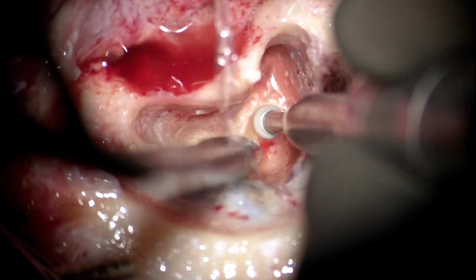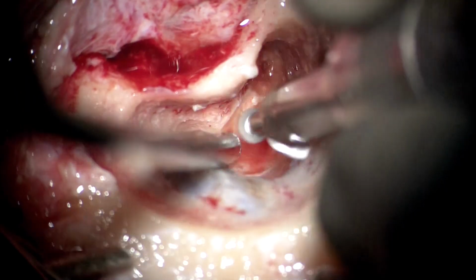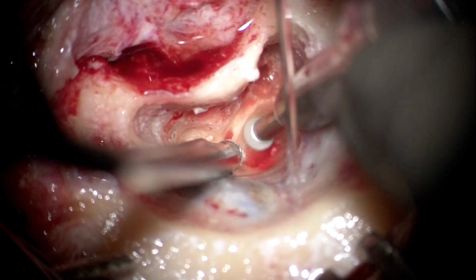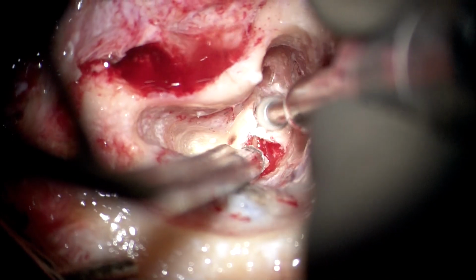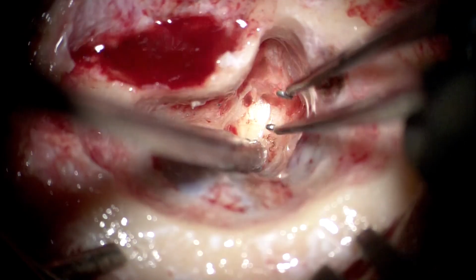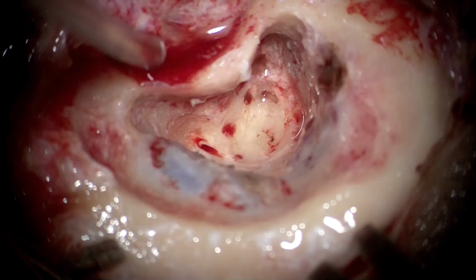This is not a difficult vessel. This will keep bleeding till we open the superior canal, and this can be dealt with either using a diamond burr or a bipolar diathermy. Here we'll be using a fine skull base bipolar diathermy to coagulate the subarcuate vessel. And this step would be required more number of times.